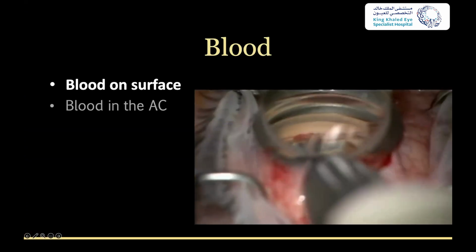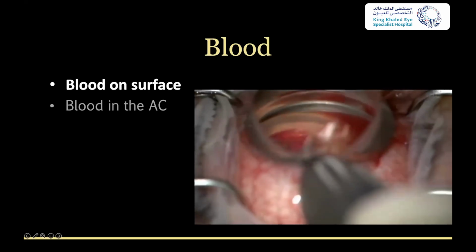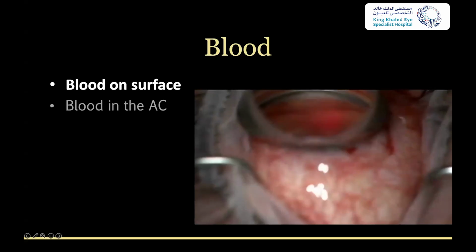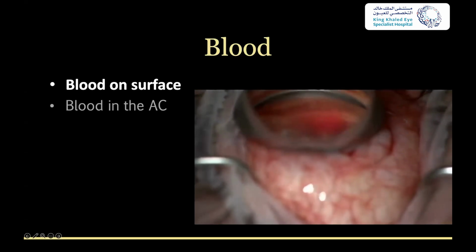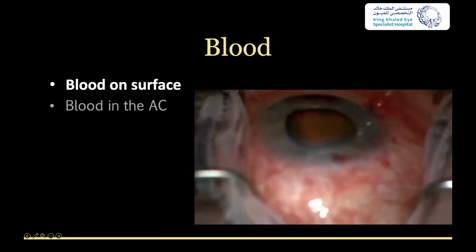So I'm just going to show you how this particular bleed that I showed earlier impacted things. You can see it's like this eclipse coming across the eye. I lift up my lens, and even though the anterior chamber is actually quite clear, I'm really not seeing a very good view. And it's not the end of the world. You just rinse it off and put more visco on top, but especially those little bleeds can continue to bleed, and it's just much more inconvenient than it's worth. So I will purposely make my corneal incisions a little bit more anterior when I know I'm going to be doing an angle-based surgery.